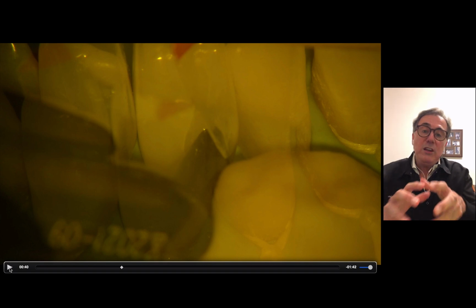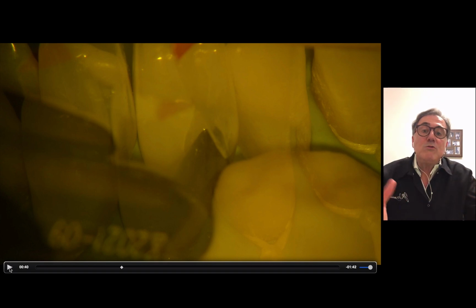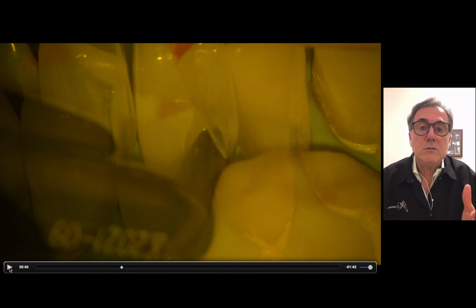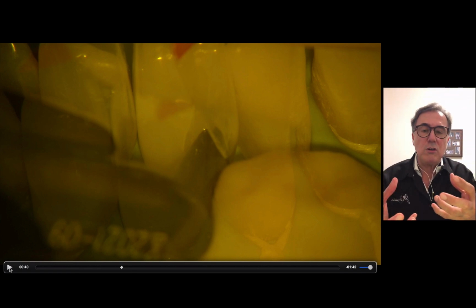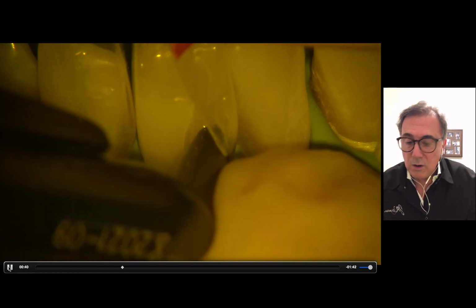When you inject the heated restorative composite, it will move the flowable composite up and out towards the tooth. So it's kind of replacing the flowable composite. Why do we use the flowable? So that we don't have bubbles. That's the important thing. We're going to have a monolithic restoration, just one piece of composite, very strong. That's our idea. So let's go on here with our restoration.